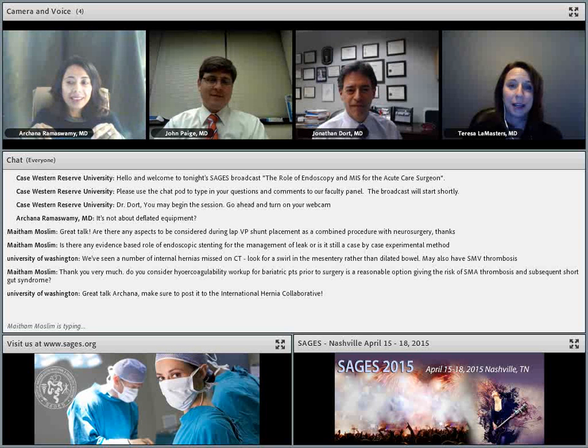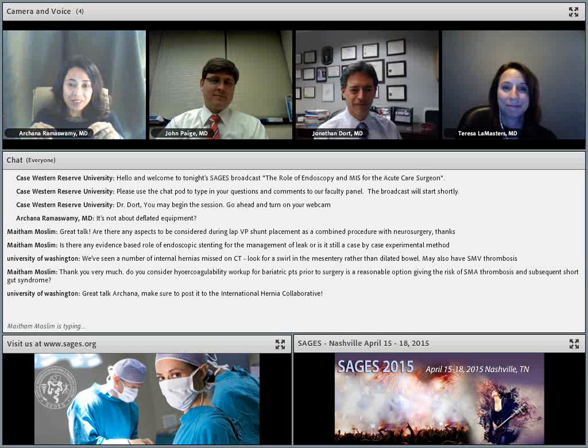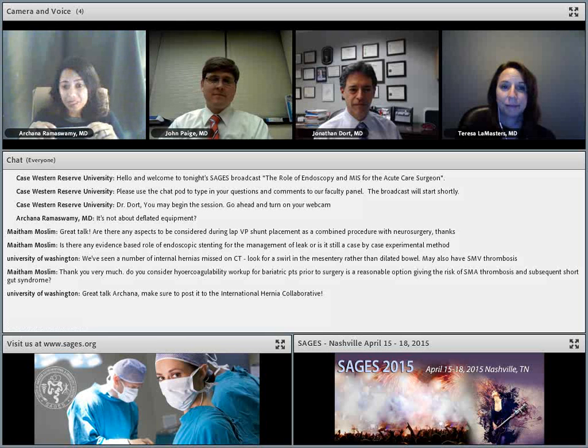I think that with all of the things that we've talked about between hernia, small bowel obstruction, and bariatrics, I find small bowel obstruction is the toughest of those in terms of saying that laparoscopy, at least in my hands, has a huge benefit. But I think what you pointed out at the tail end is really the fact that it often helps you minimize that incision that you're going to have to make, because it really helps guide you in terms of where you need to go. And often I find you still have to open, but maybe it's a smaller incision than what you needed.